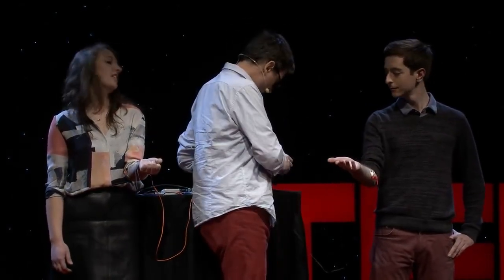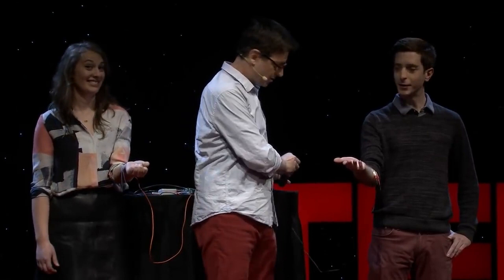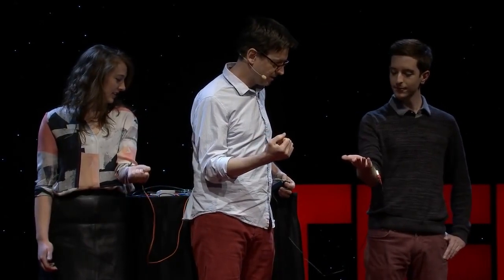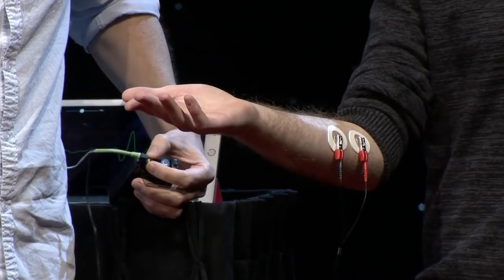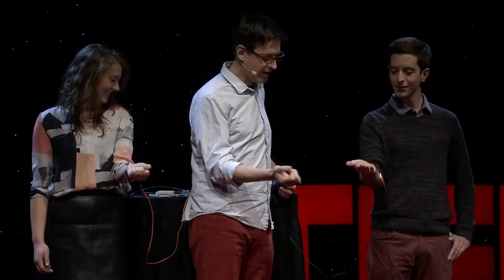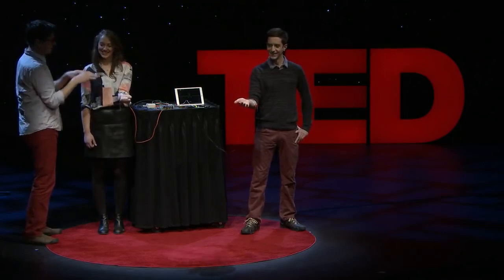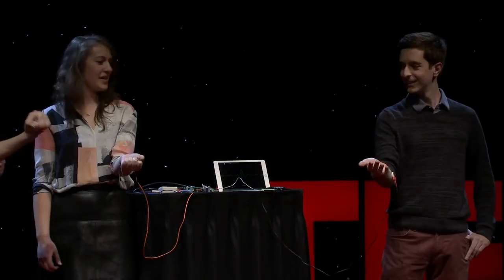Are you ready, Miguel? Ready as I'll ever be. So I've turned it on. Go ahead and squeeze your hand. Do you feel that a little bit? Do it again. A little bit. So relax. Hit it again. So now your brain is controlling your arm, and it's also controlling his arm. Go ahead and just do it one more time. That's perfect.